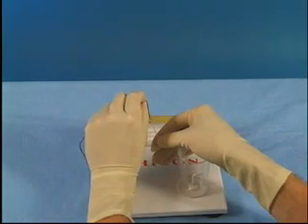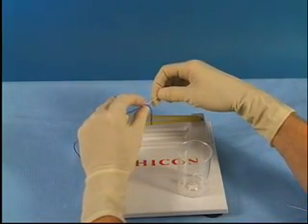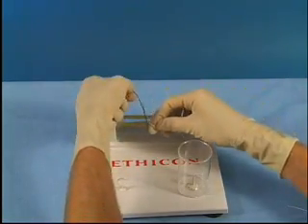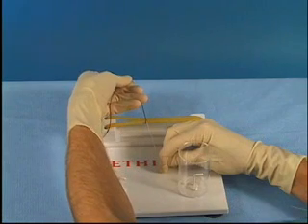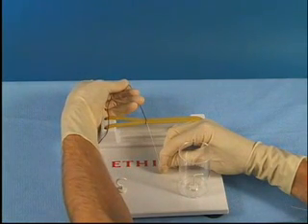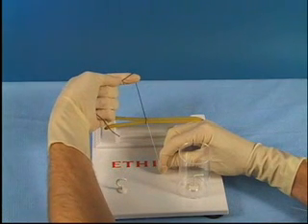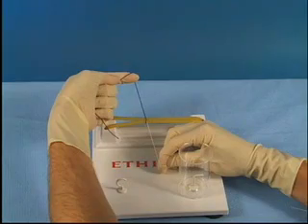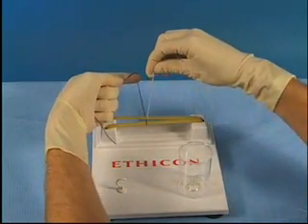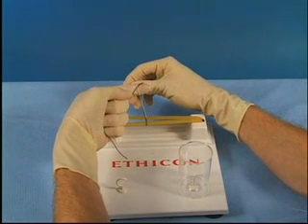The hand is rotated back through the loop, pulling this strand through the loop. The left hand is then pulled up and away from the surgeon to tighten the two strands into a single throw. When this throw is completed, the index finger of the left hand is again looped under the suture material. The right hand is brought up and across, forming an X on the index finger.